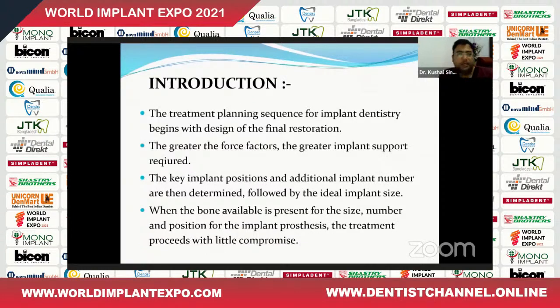Now, next, in the introduction, the treatment planning sequence for implant dentistry begins with the design of the final restoration. The greater the force factor, the greater the implant support required. Now, the key implant position and additional implant number are then determined, followed by the ideal implant size. When the bone available is present for the size, number, and position of the implant prosthesis, the treatment proceeds with little compromise.